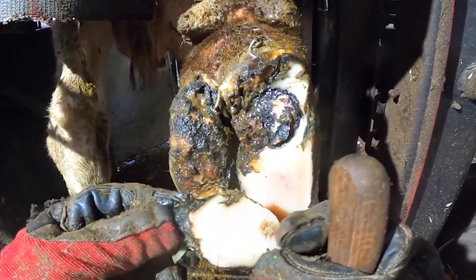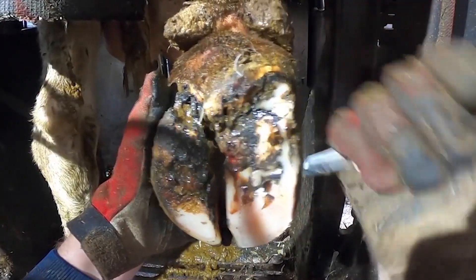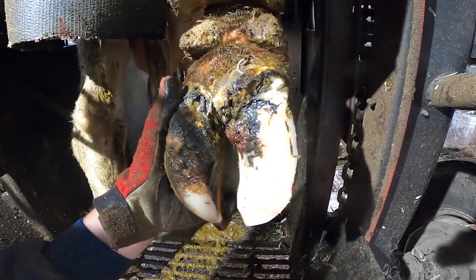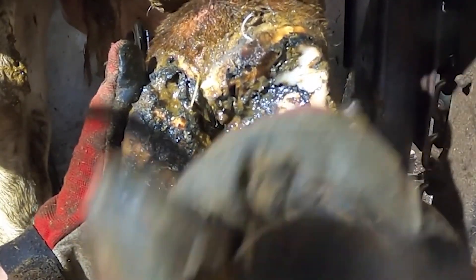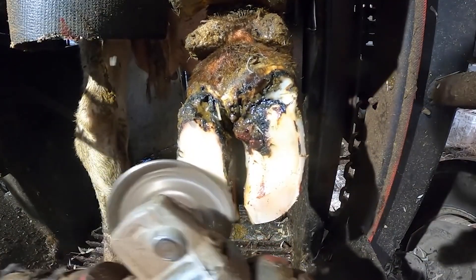This chunk of detached hoof horn was covering a huge ulcer. I'm going to need to remove every shred of detached, cracked or loose horn from around that ulcer site, and I need to be as careful as possible that I don't cut into that raw flesh and cause the cow any unneeded pain.